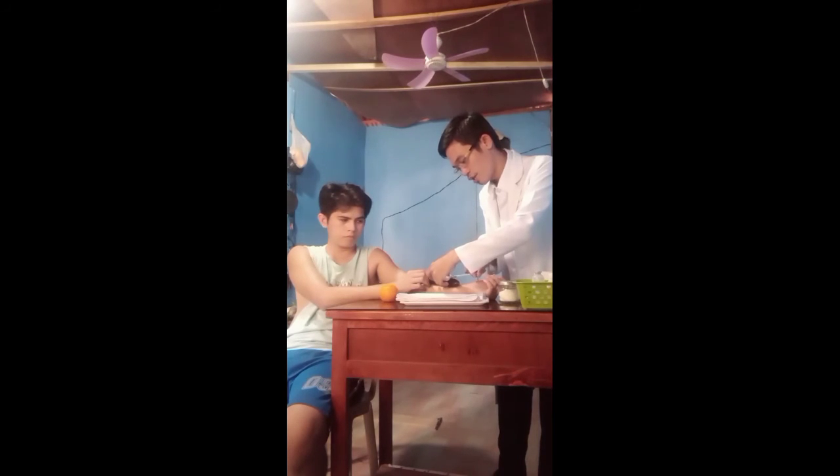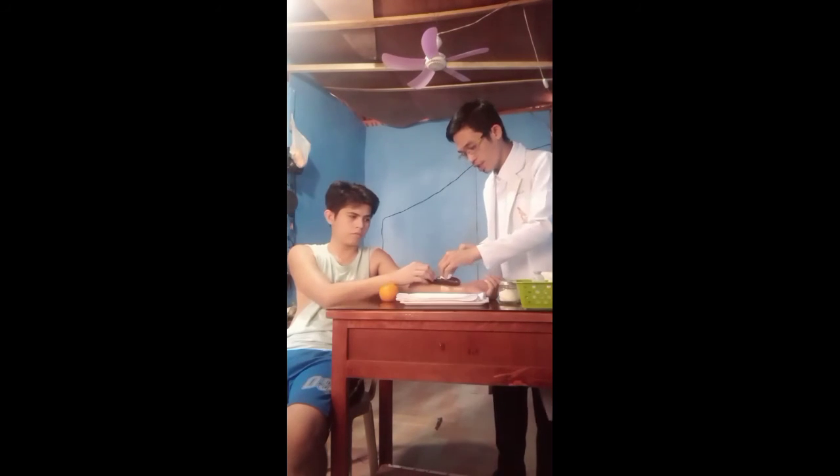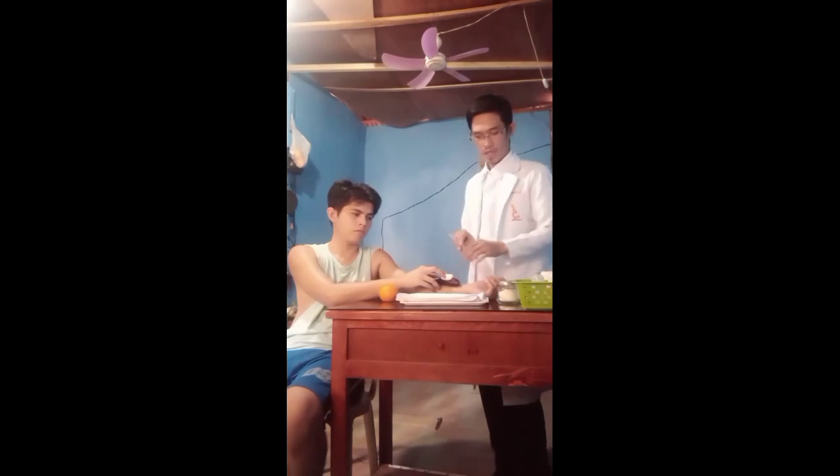Okay, done. Do not massage, just gently remove the needle from the arm of your patient. Then after using, return the cap onto the needle and put it in the waste receptacle.